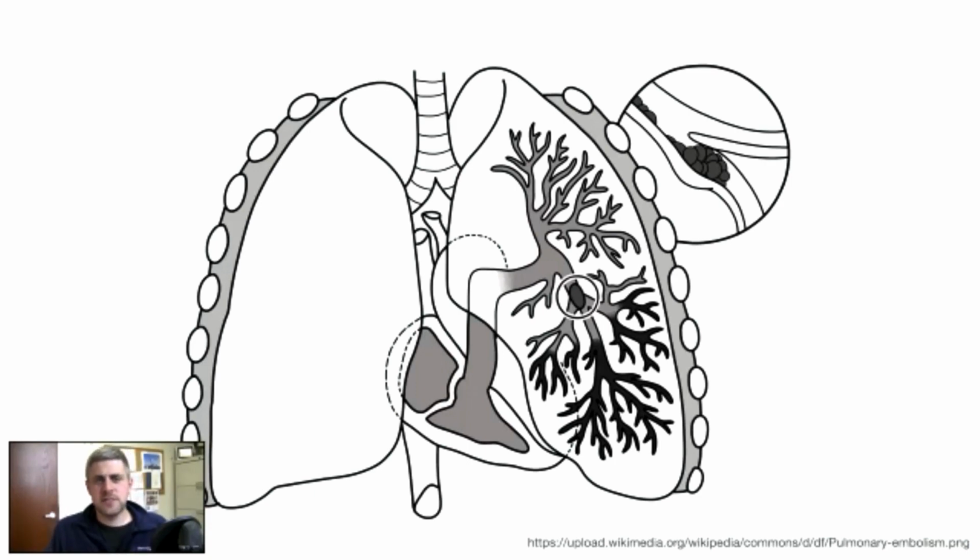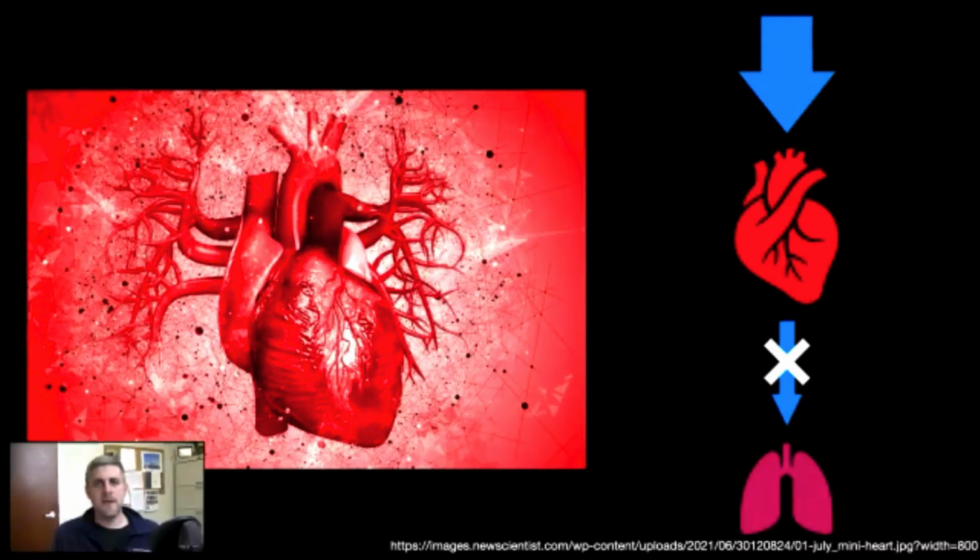But what we don't oftentimes think, at least first, about is the effects upstream and what that clot does to the right heart. And that's kind of what we want to talk about today. Some of the parameters that we're going to see as we ultrasound these patients.